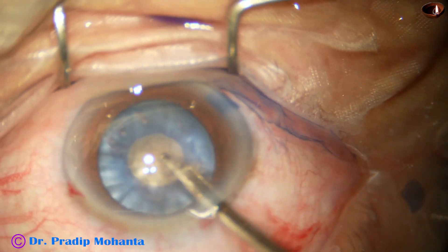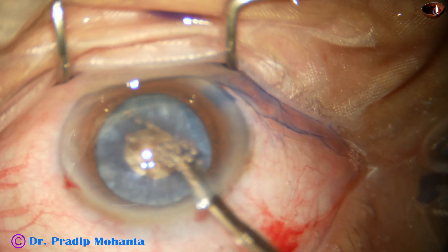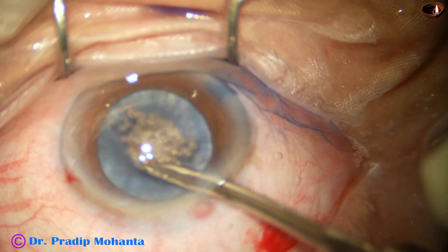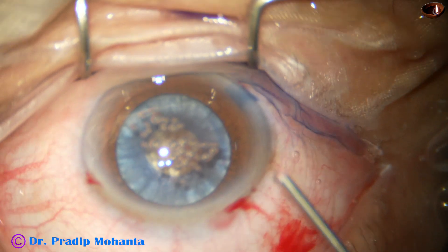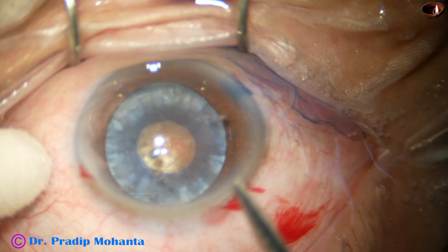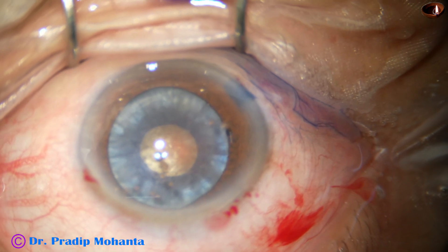I aspirate some cortex. I use a 23-gauge Simcoe cannula with a few movements; the nucleus mobs and we can remove cortex from all around. When the intralenticular pressure is reduced to optimum level, inject viscoelastic and make a small nick at the margin of the mini-rhexis in an oblique way — not a radial cut, an oblique cut.